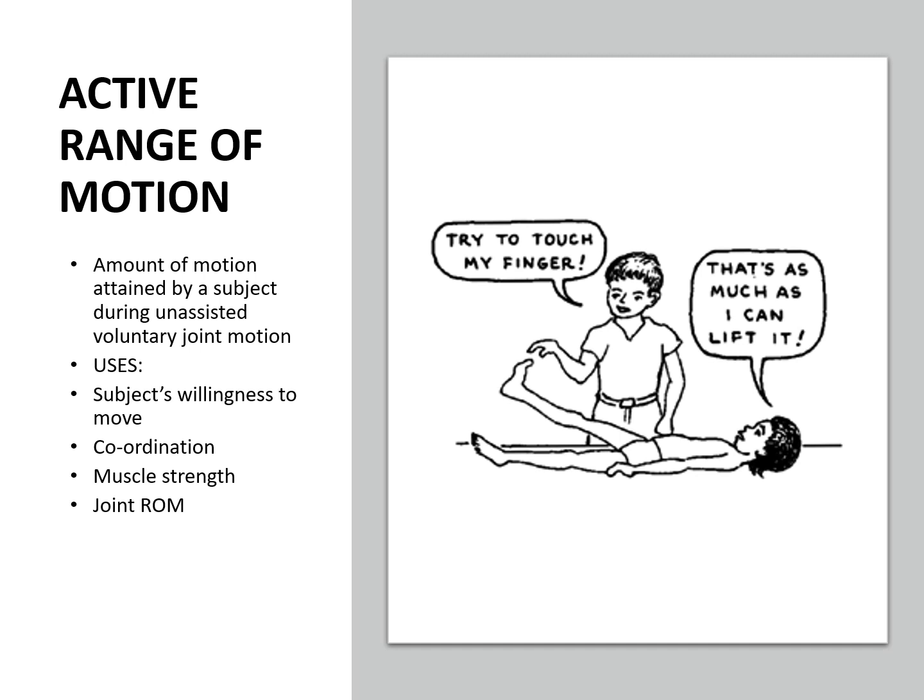Thirdly, it will help us understand whether the patient has enough muscle strength to complete that range of motion. If the muscles are weak, definitely the patient cannot complete the movement. So it will give you some idea whether the patient has strong or weak muscles in order to complete that movement. And lastly, when you are using a goniometer, it will tell you about the degrees of range of motion, or the amount of range of motion available at a particular joint.